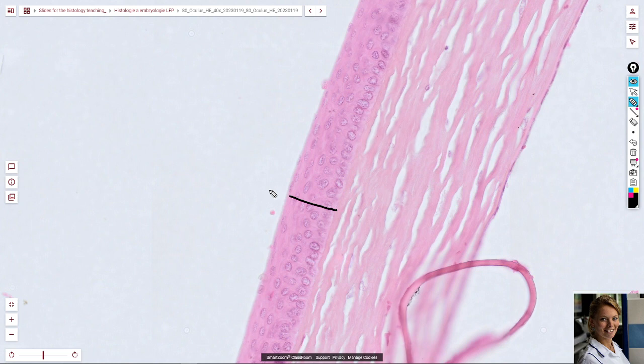The cells in the surface layer have the microvilli and glycocalyx at the apical surface, but not visible in this magnification. Cells of the basal layer are cuboidal and rest on the anterior limiting membrane of Bowman. It's here. It's a Bowman's membrane.